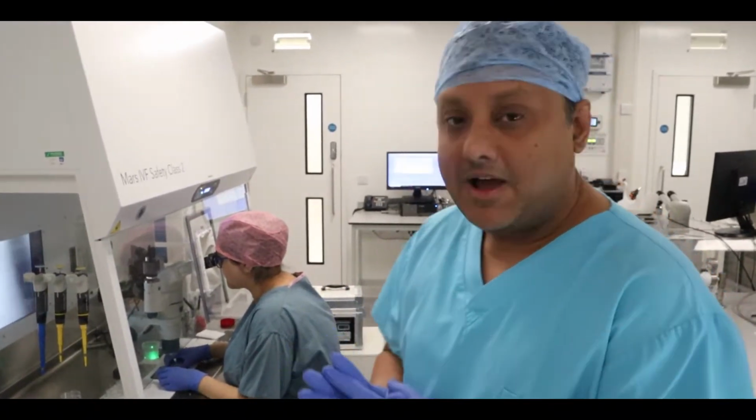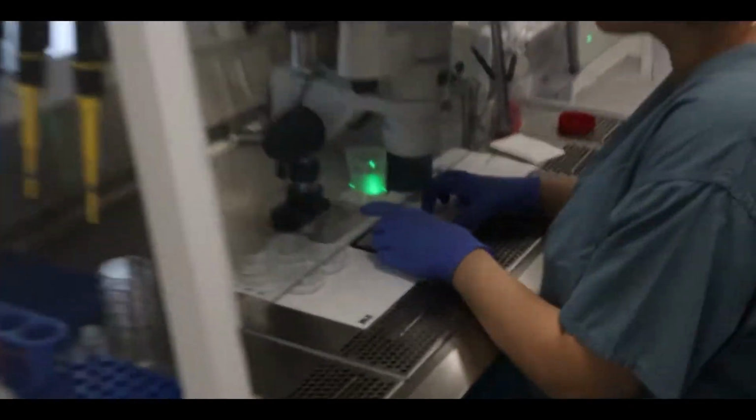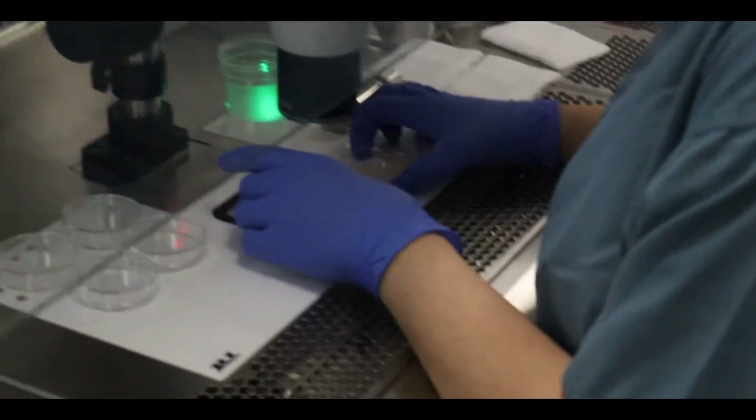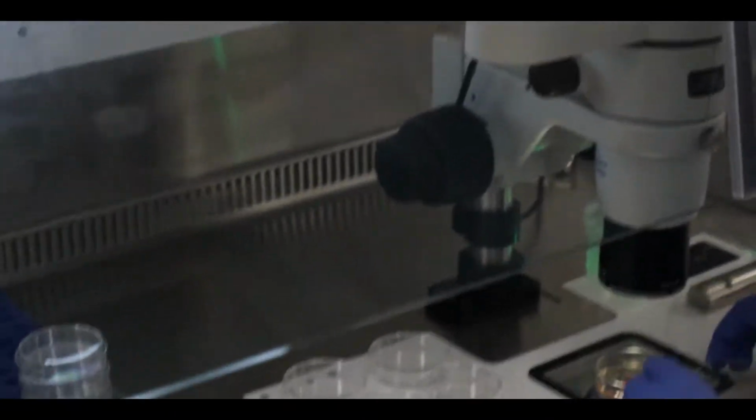So here we are, we're all ready. The first tube has already come in, and the embryologist is looking at the follicular fluid, trying to look for the health of the cells and also trying to look for the egg. And here we are, we've got the egg. The embryologist is communicating with the doctor, letting them know. And that's a mass of cells there that contains the egg. So we're winning so far. 1 follicle punctured, and we have got the egg.